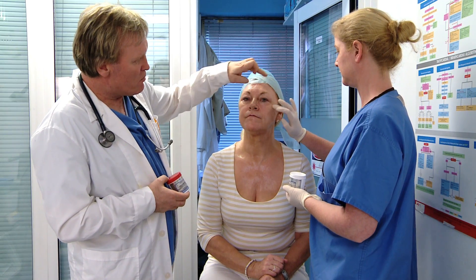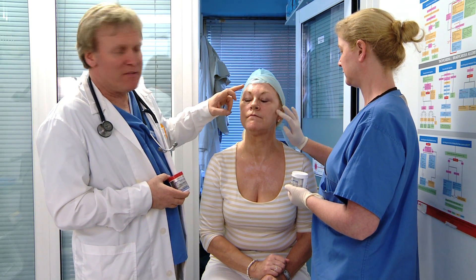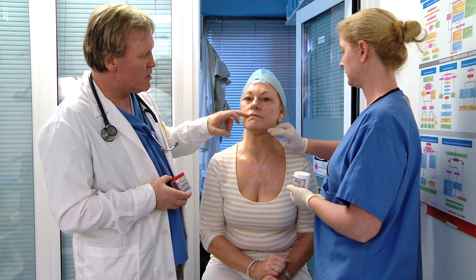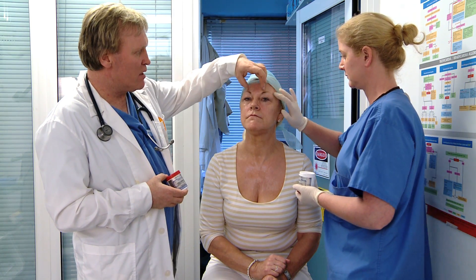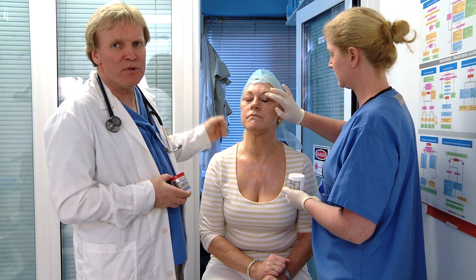In terms of the topical anesthesia, we really only need to apply it to the lateral aspect of the face, because the regional nerve blocks will tend to cover most of the perioral area, and we can also cover the frontalis through the supraorbital nerve.